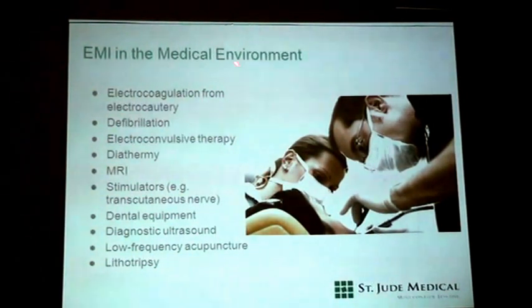In operative equipment, electrocoagulation, defibrillation, and ECT in psychiatric patients, you have to be very cautious. Don't use diathermy or MRI, or stimulators such as in orthopedic patients, where the vibrations are better avoided. Dental equipment, dental drilling, can sometimes change the settings. Diagnostic therapeutic ultrasound with vibrating mode must be kept in mind, and of course lithotripsy.